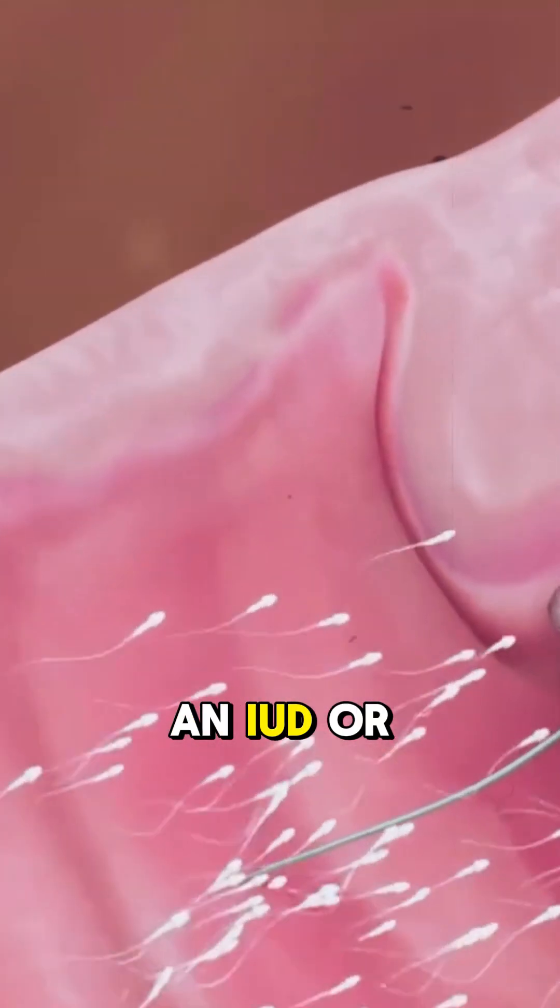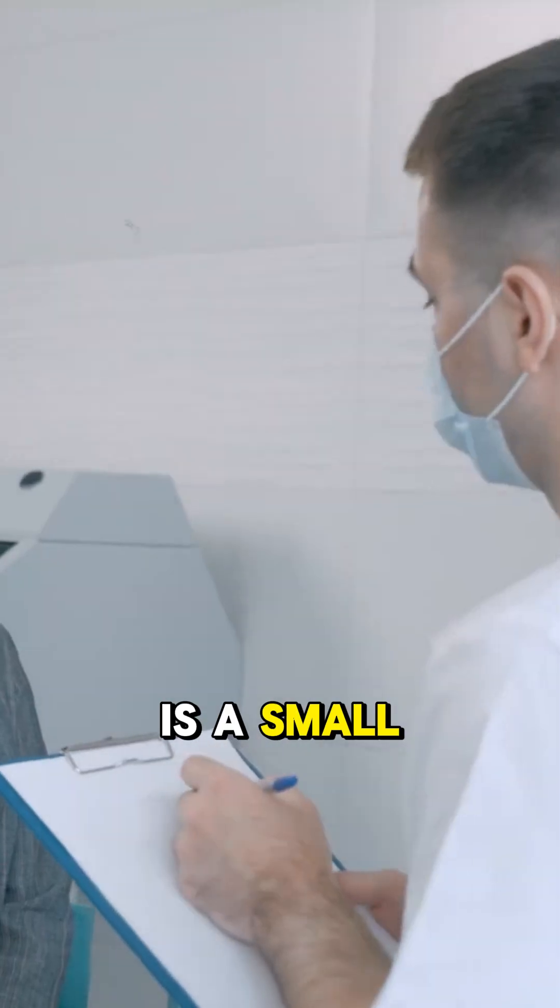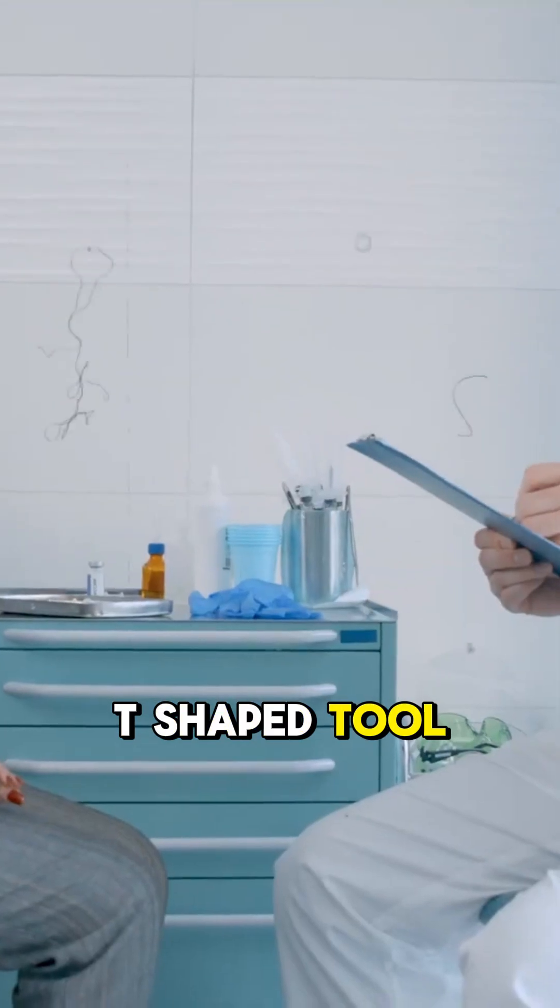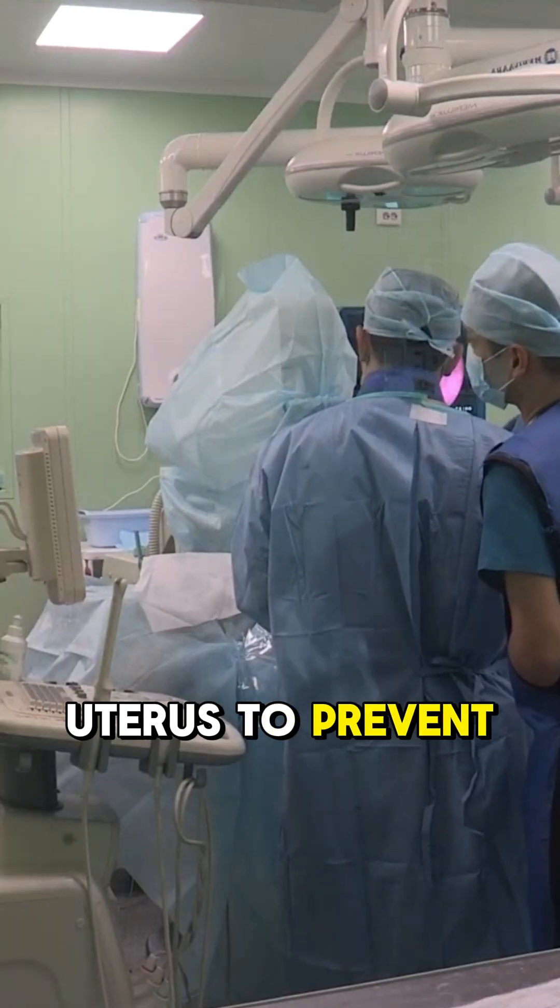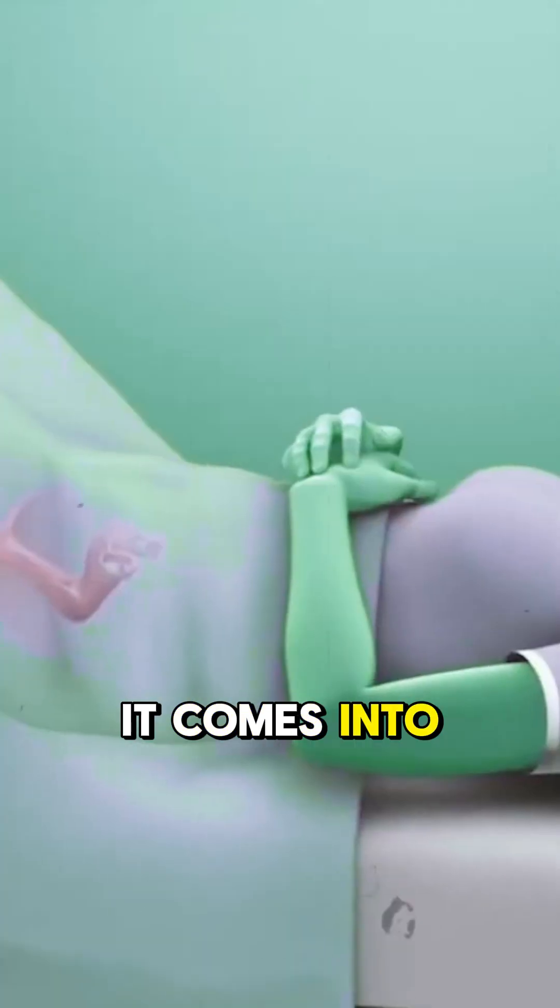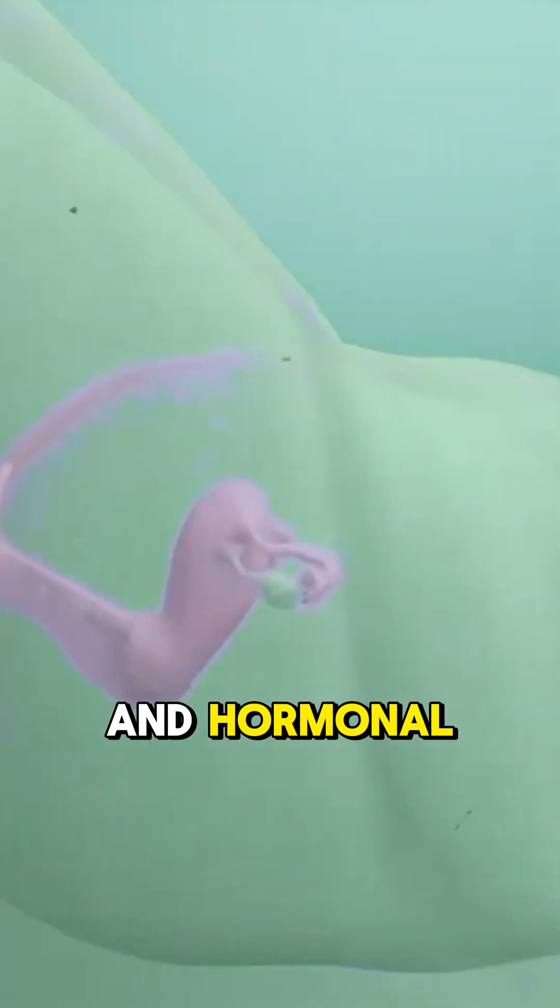An IUD, or intrauterine device, is a small, flexible, T-shaped tool inserted into the uterus to prevent pregnancy. It comes in two types: copper and hormonal.